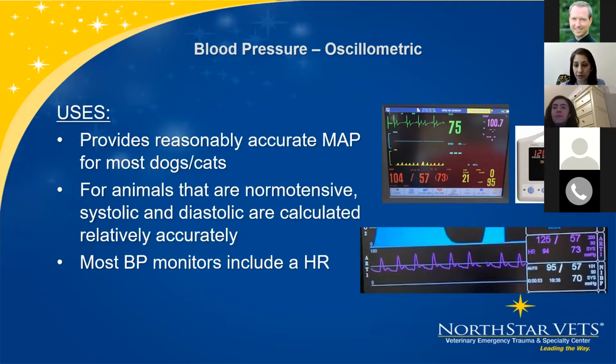Most of the blood pressure monitors do include a heart rate, where you can look at what heart rate it is detecting and then gauge whether or not you choose to believe that blood pressure. If it captures an accurate heart rate, perhaps the pressure is real.